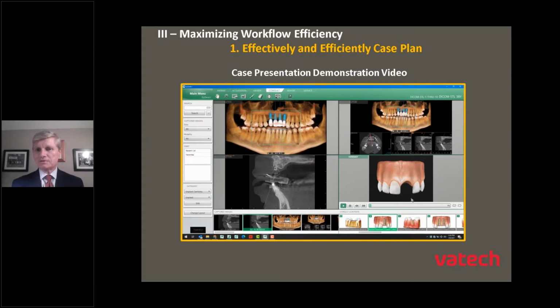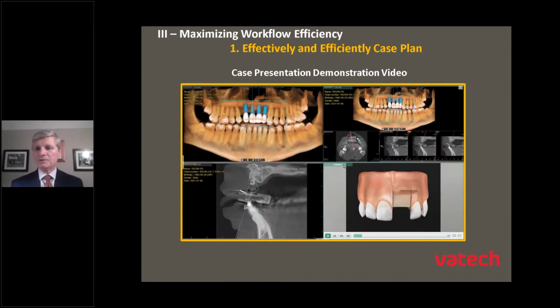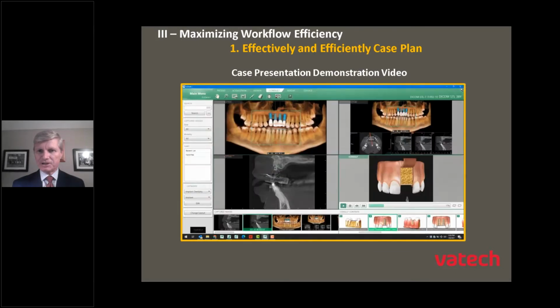if you can explain to them the amount of time that goes into planning this and the reason why 3D technology is so much more beneficial, because now I can generate these type of cross-sectional views that I can't get from a 2D perspective, and being able to use a video like this just to help explain to the patient, okay, where you can be using a drill to kind of drill through the bone, and helps to explain to the patient what's included as part of this actual surgery itself.